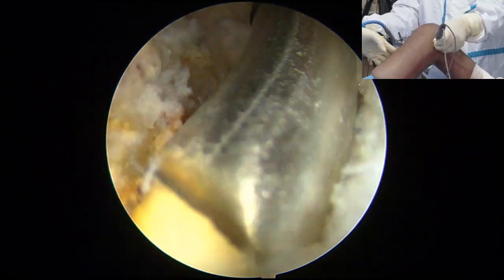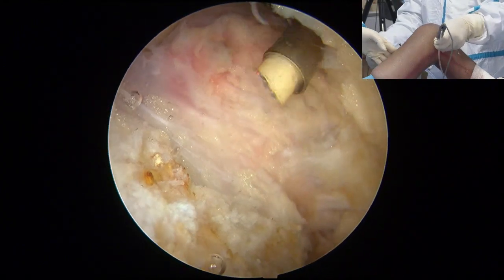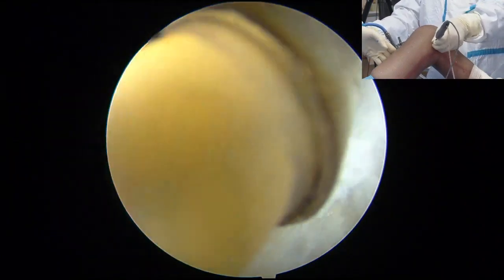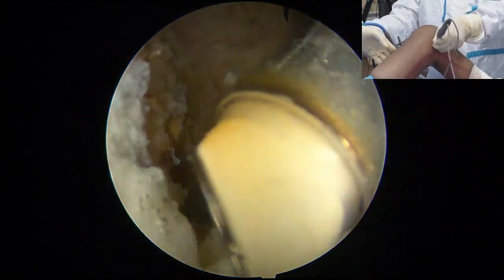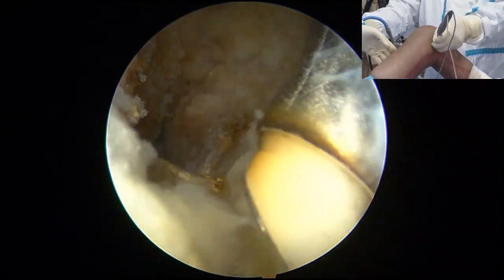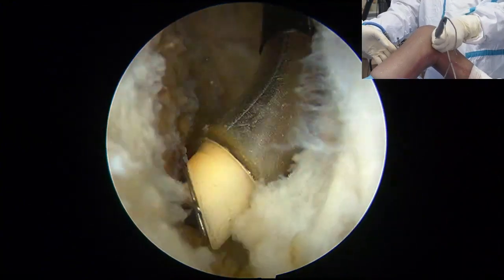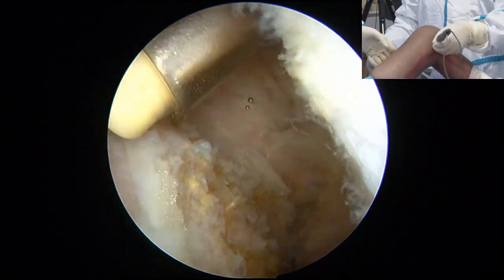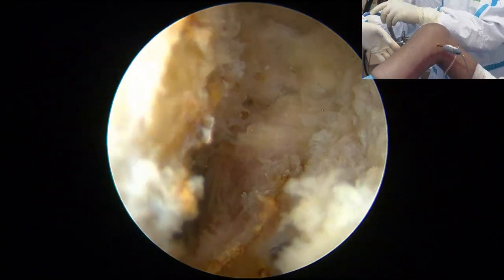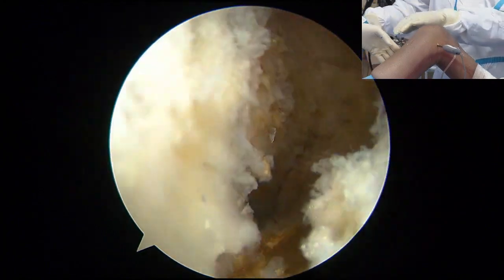那我现在标记的就是 PCL 的止点。那 PCL 止点还有重建的时候呢，经常犯的一种错误就是重建点偏高。因为 PCL 的重建点要偏低才比较好，因为 PCL 呢还有一个受重力作用下坠的这种特征，所以如果重建点太靠上太靠近端的话就有点松了，所以 PCL 的重建点应该靠低。Okay, good. So I think I will stop here. You can see very well the posterior compartment. You can see condyle, femoral condyle, you can see meniscus. You can see popliteus, you can see everything now, okay? So we are now ready for the PCL reconstruction and popliteus reconstruction.